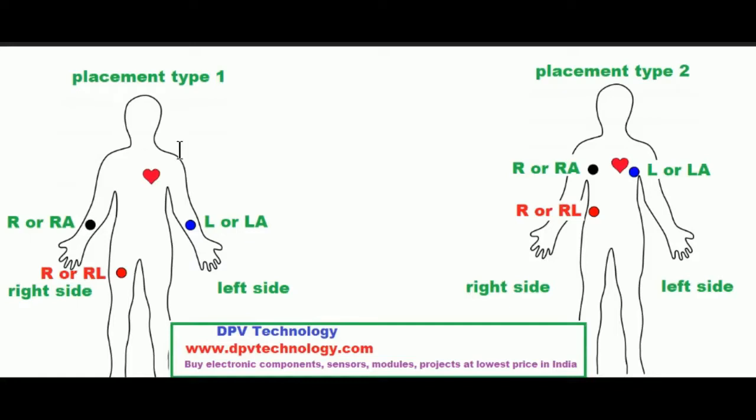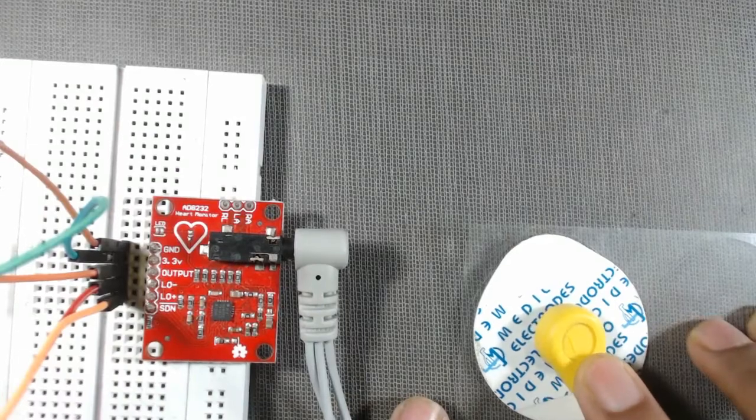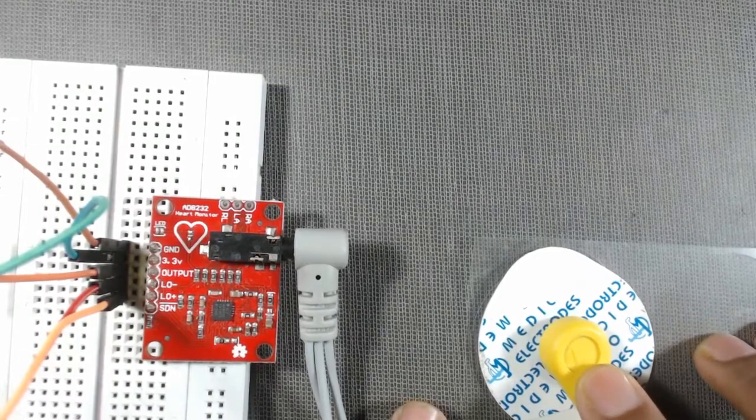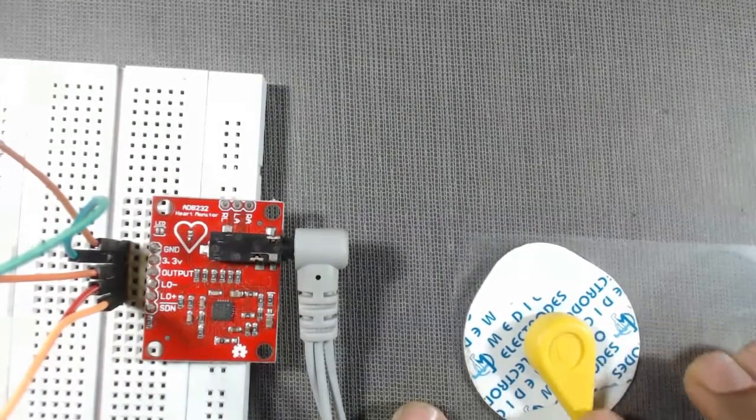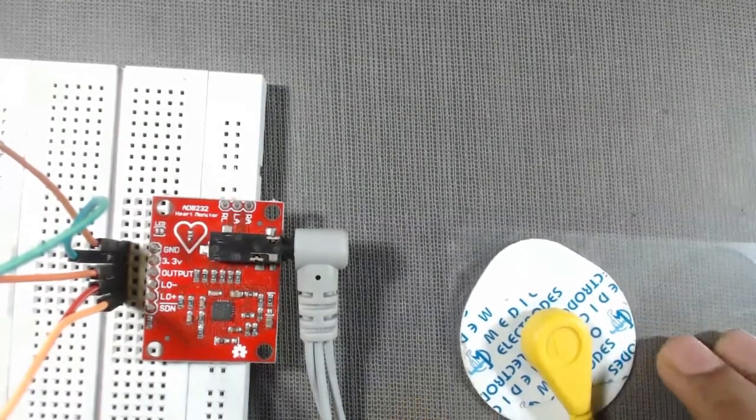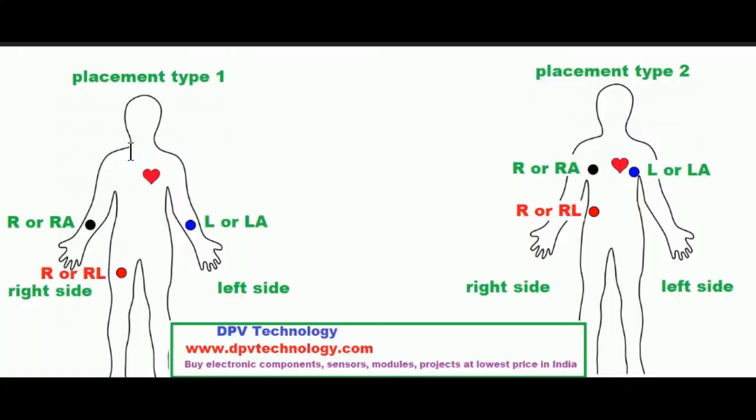You can place either one of the following types. You will find the cables with different colors. The cables on which L or LA will be written, that must be placed on your left hand or left chest.